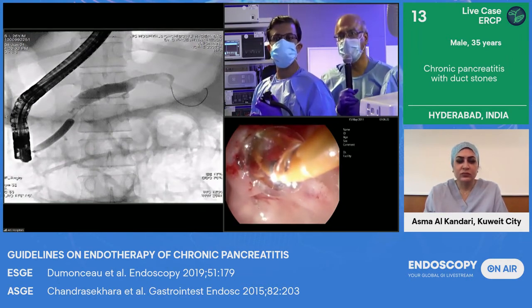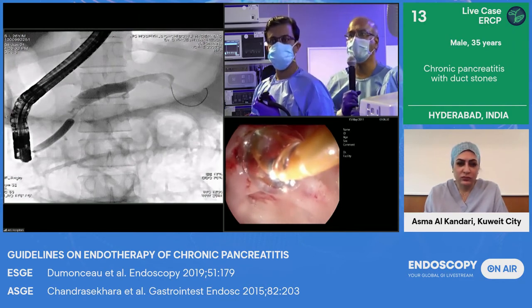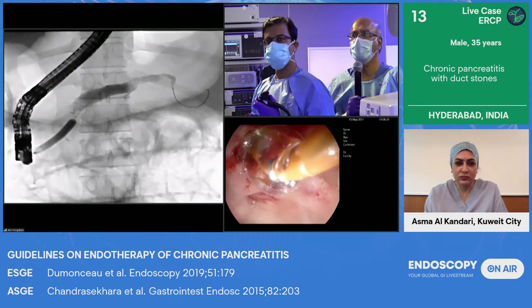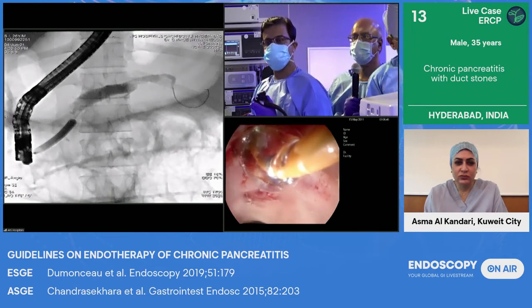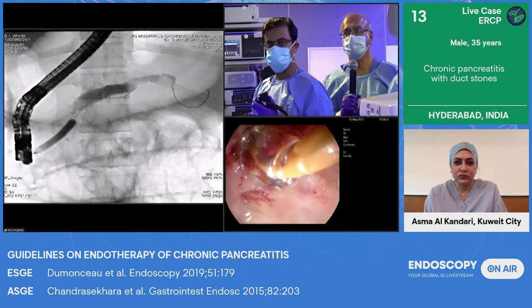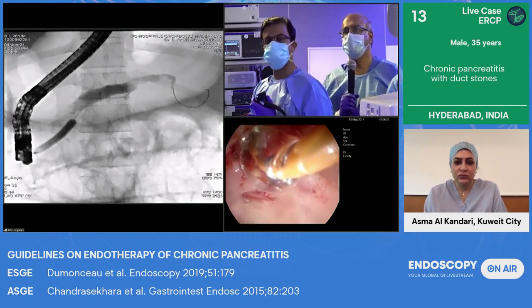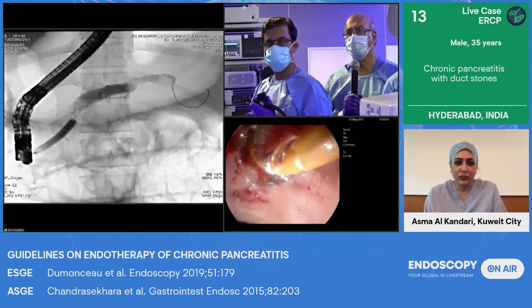So I have done a large balloon, 6 mm. Yeah, you can now see the balloon on the fluoroscopy, now nicely dilated. So I'll wait for a minute. The waist is gone. So this will give you adequate drainage of the fragments, and also there will be a faster decrease in the intraductal hypertension. So this obviously merits a plastic stent, a pancreatic duct plastic stent, because that will decrease the intraductal hypertension faster and also helps in giving a pathway for flushing of the fragments.